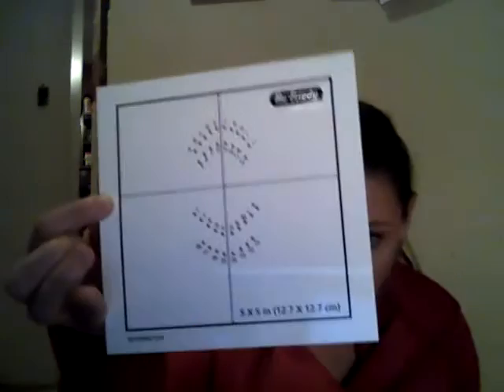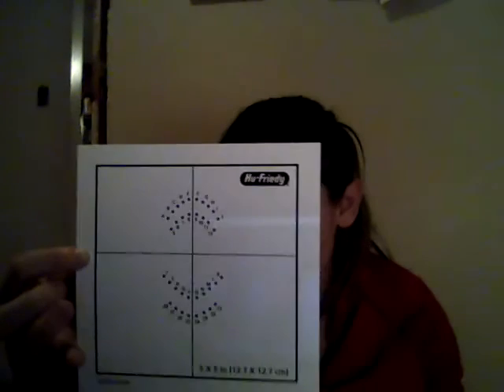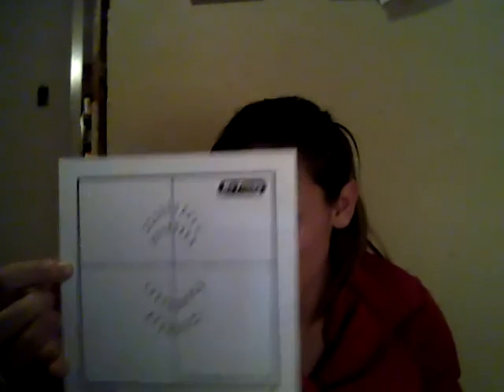We have our dental dam, which is going to be a barrier to isolate selected teeth. We have our dental dam template — we place it on the dental dam, use a pen to mark through the template to indicate the location of the hole punches. We have our rubber dam punch, which actually punches the holes in the dam for the selected teeth.